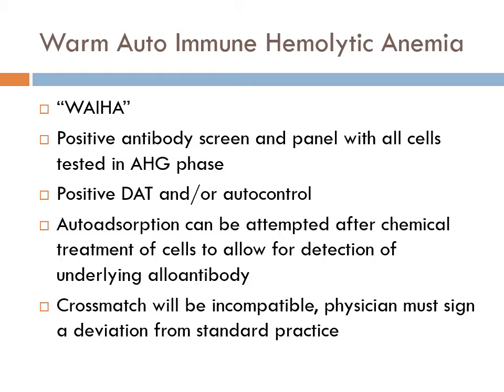We can only do this if the patient has not been transfused recently. Why? Because we don't want to adsorb onto the donor RBCs, which may have those antigens on there. We could risk absorbing out clinically significant antibodies.